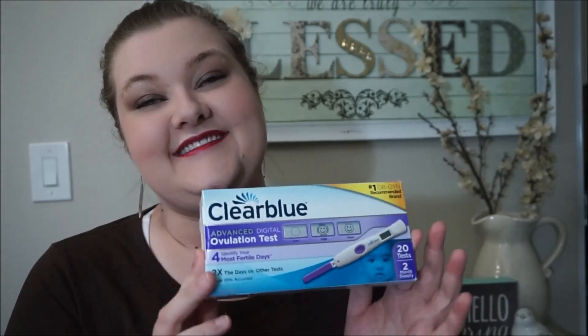Hey everybody, so I had briefly mentioned in one of my TTC vlogs that I was going to do a first impression of the Clearblue Advanced Digital tests, because this was my first cycle that I had ever used a digital ovulation test. I'm in my 28th cycle now, and out of 27 cycles I actually used the digital tests and I didn't want to do a complete review just yet because I've only used them for one cycle and I was very unsuccessful both with these.